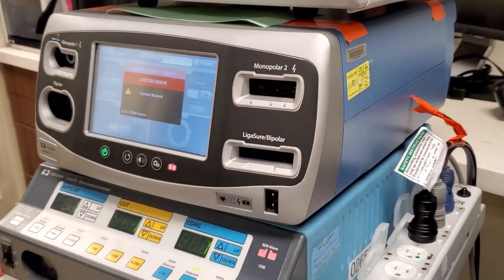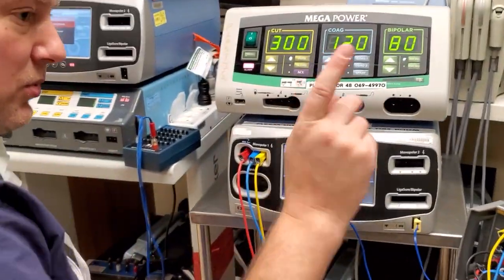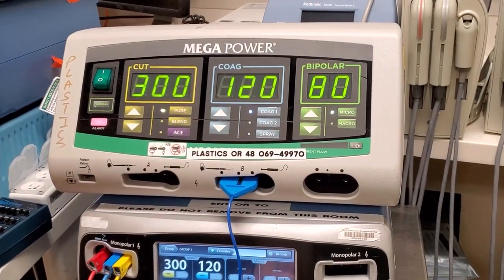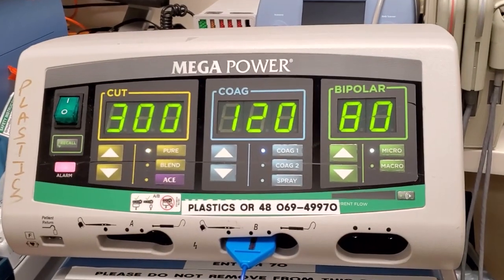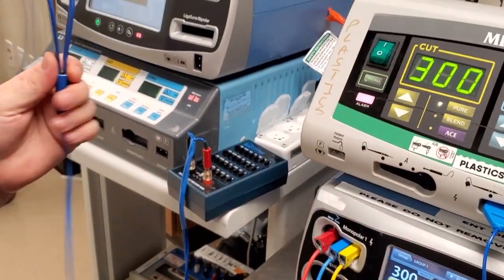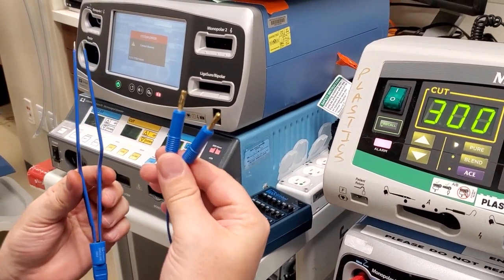Based on that is how you're going to be testing your devices. You have a monopolar which requires the pencil, and it's activated by the pencil usually, or there's a foot control in the back of every single ESU. Now, bipolar is one of the most common uses on any ESU. It often resembles something like this — just a set of pliers and two banana plugs that plug right in the front.